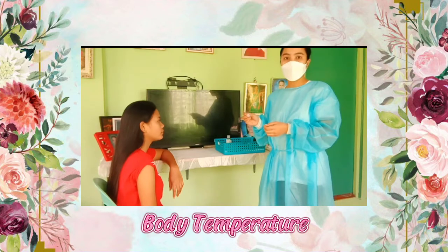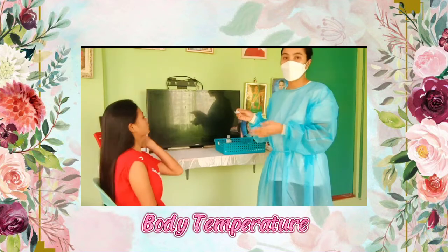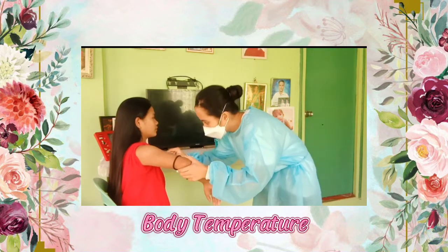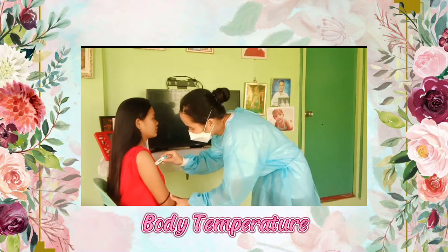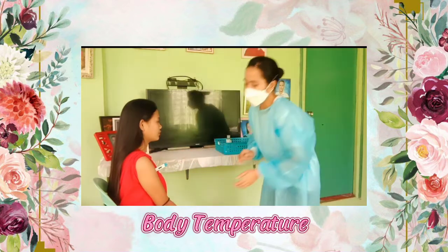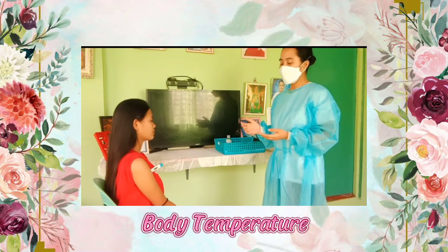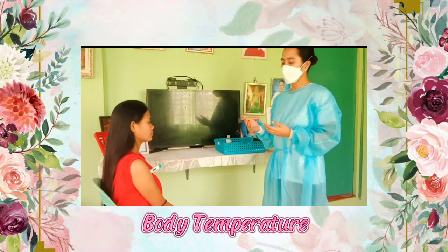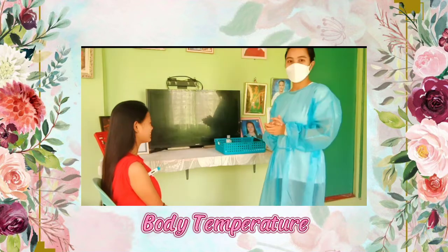Now we're going to insert the thermometer into the patient's axillary site. Please raise your arm, ma'am. So now, we will wait for a minute until the thermometer beeps, which indicates that the temperature is already obtained.